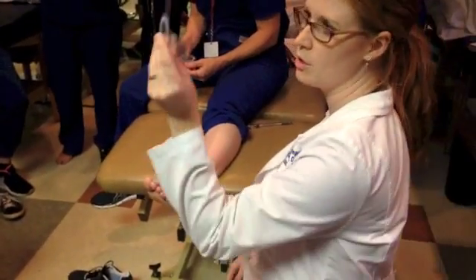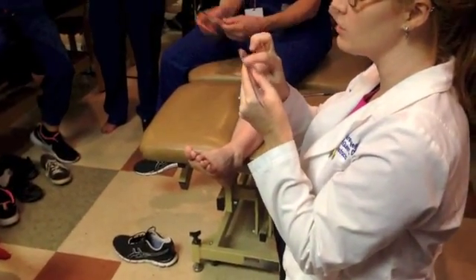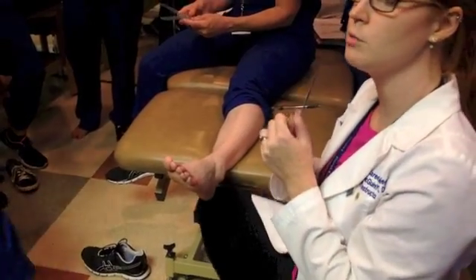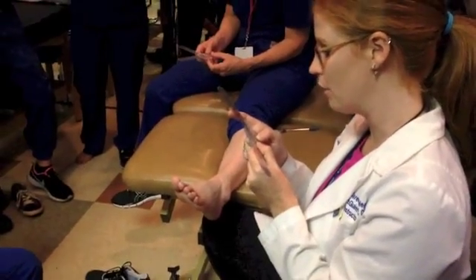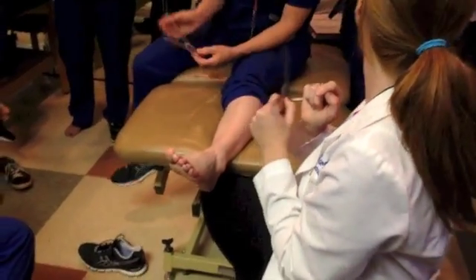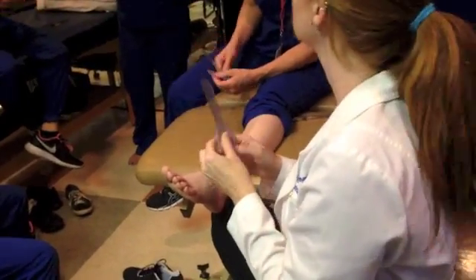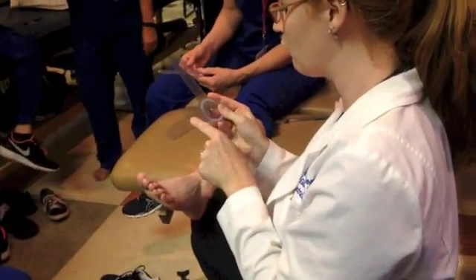Everyone take a look at your little plastic goniometers. On the outside, there are some red numbers on the outermost circle — where it says 0, 20, 40, etc. Those are the numbers you're going to be looking at for these measurements. So if you get a measurement that says 130, that doesn't make sense — that's actually 40. The black number will be 90, but we want the outside red number of 0.